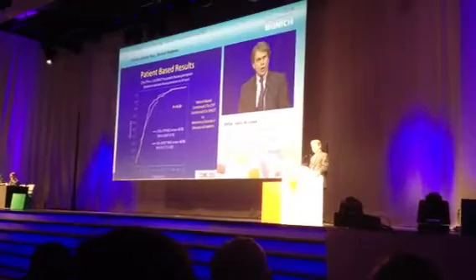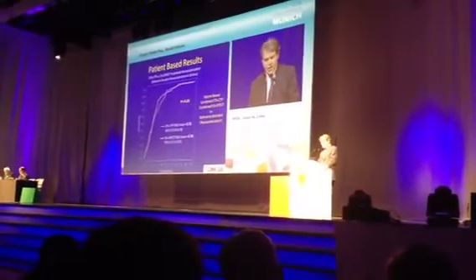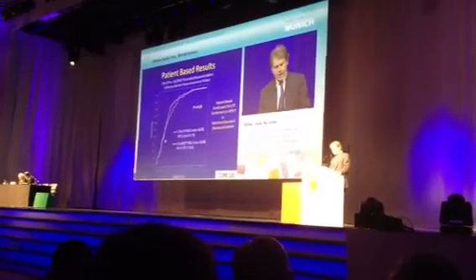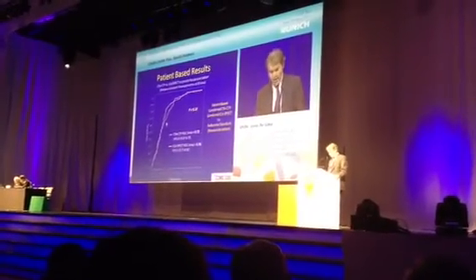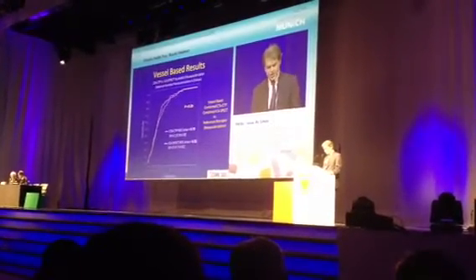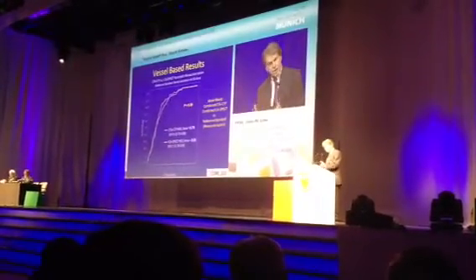Now, finally, looking at the reference standard here of patients who went to revascularization, both the combination of ICA and SPECT in gold and CTA, CTP in white were able to differentiate or to predict quite well those patients who went to revascularization, if you analyze it by patient or if you analyze it by vessel.